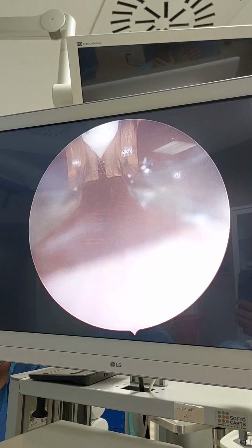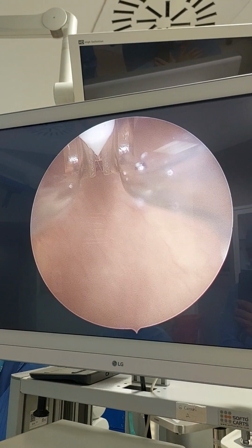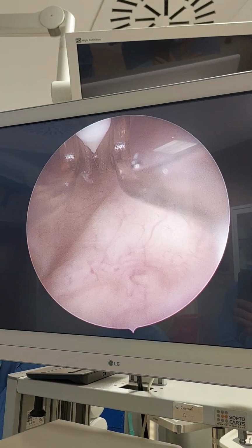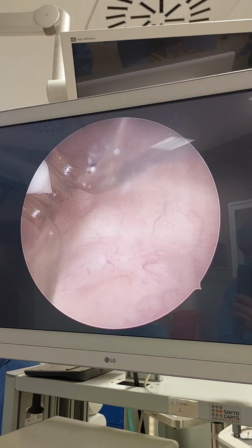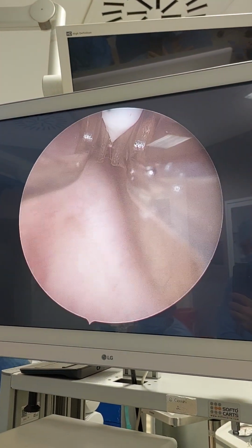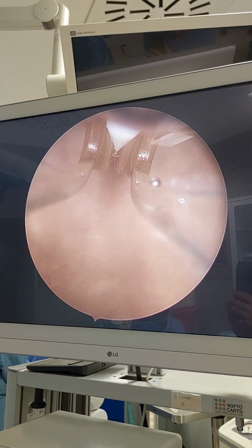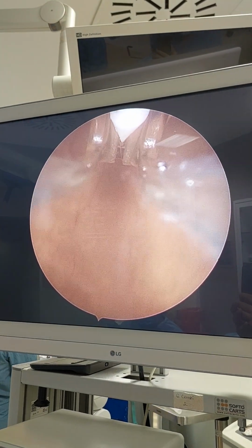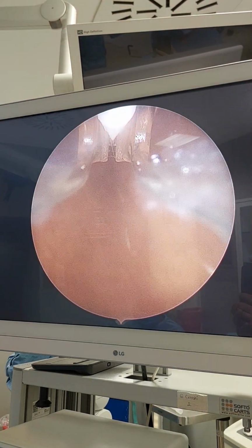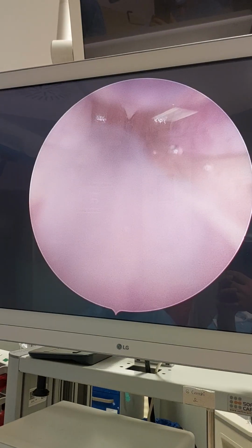And you see the floating particles. They are really related to infection. So I will drain the infection first to increase the effect of the hot steam, and then we'll give the steam inside. Bladder seems normal. There's no tumor, no other things. There are slight trabeculations, not too much. And now I will look into the prostate.